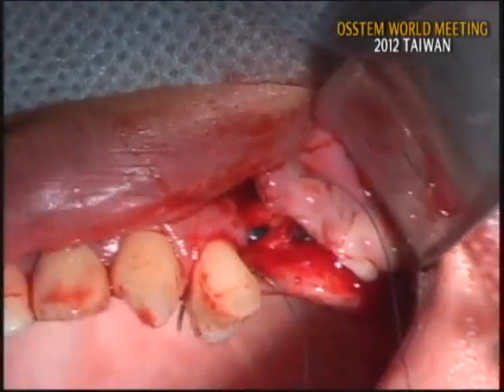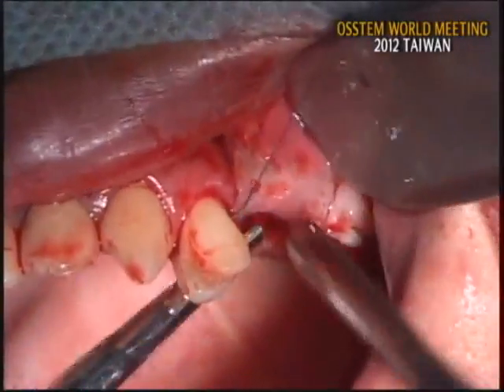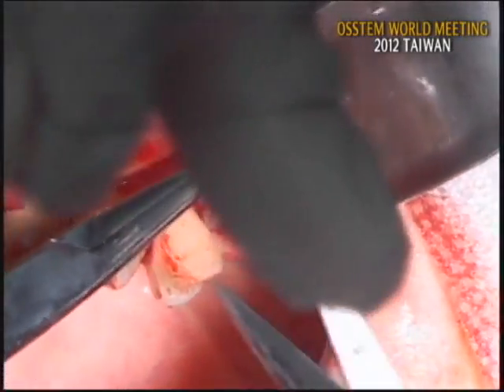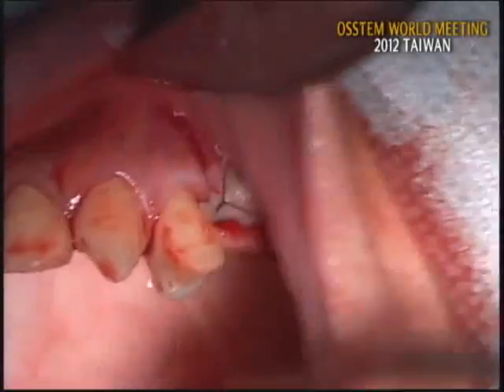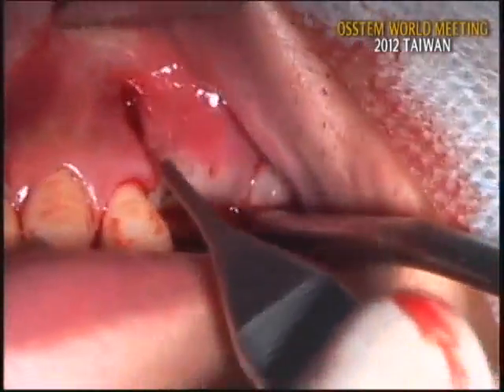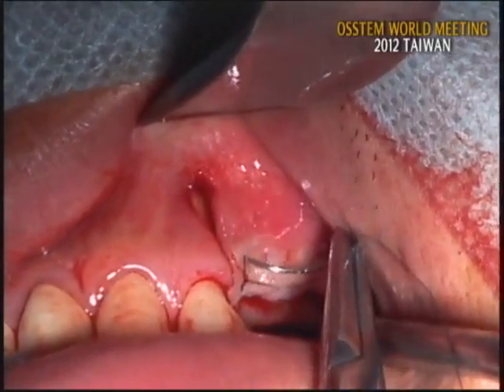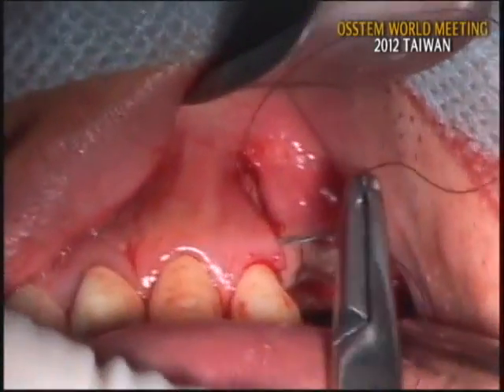Okay, first hold the corner. Next, I'll close the vertical line. You see, my assistant is retracting parallel with the incision line, so it is easy to close this area, and she's continuing the suctioning to make a good surgical field. Okay. Pass the mucosa carefully, not to tear.